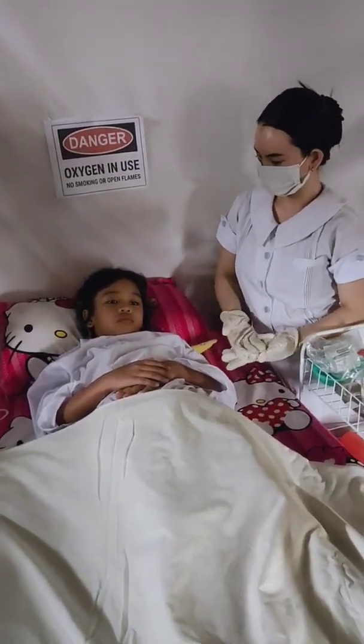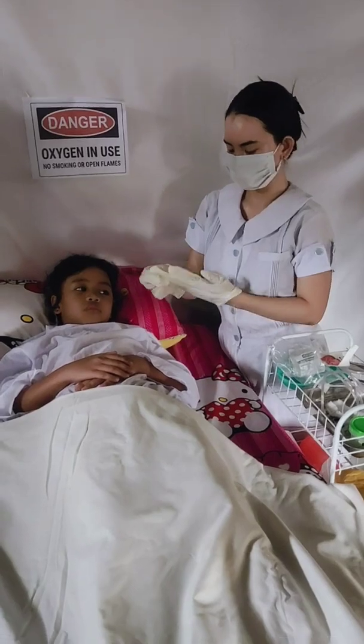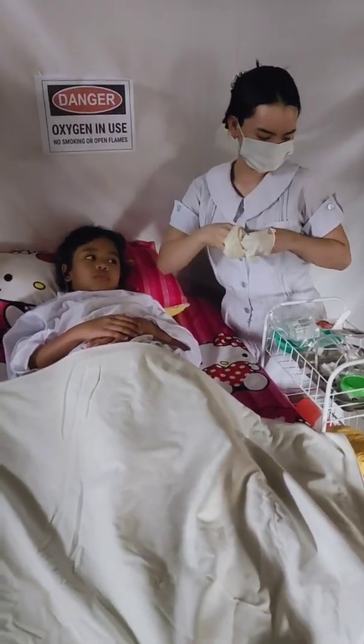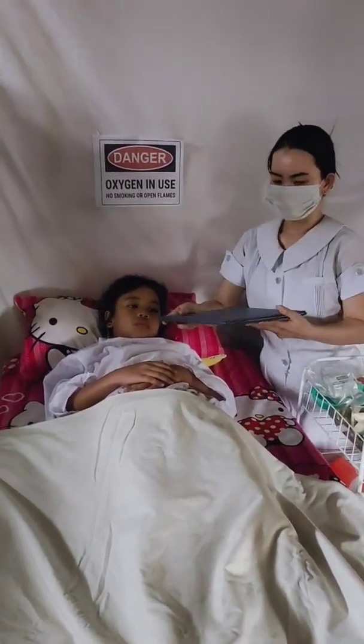After that is the evaluation. Reassess the patient to determine the response to administration of oxygen by nasal cannula. The patient's response to oxygen therapy by nasal cannula is effective because the respiratory status goes back to normal.